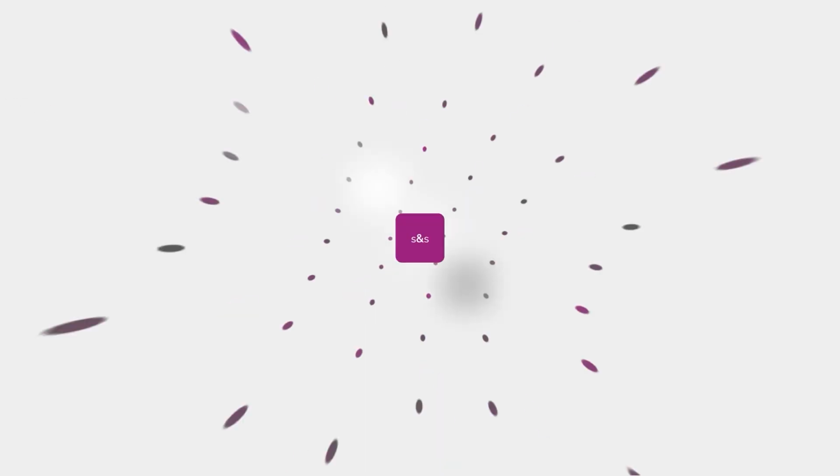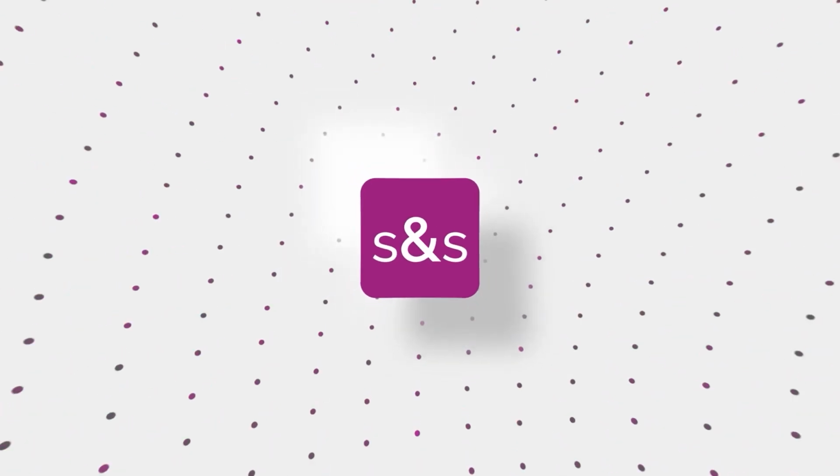Hi everyone, today I would like to give more information in case your dental chair is not moving up and down or the backrest is not moving back and forward. So please check it out. There are different situations that can cause malfunction of the dental chair movement. So we need to analyze which one is the one that occurs in your clinic.